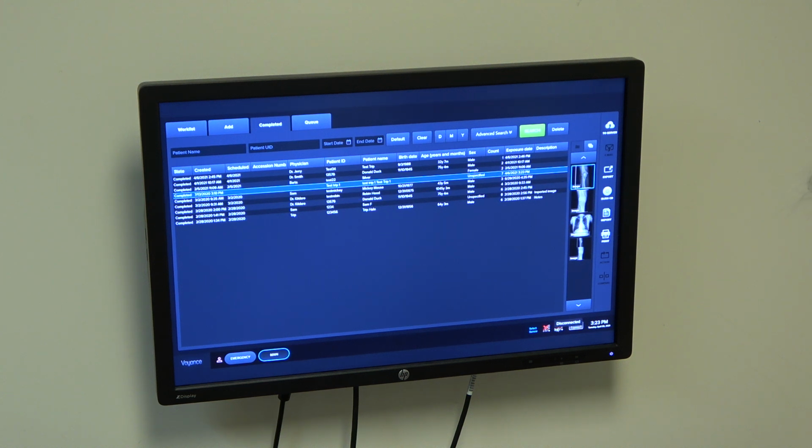We have, in this case, we want to talk about the dual panel. This system works very well in what we call a hybrid dual panel environment. So what we would do is we would sell the customer, or the customer would purchase 2 wireless DR panels. In this case, it would be the 17 by 17. You can do it with a 14 by 17. Typically, we sell 2 17 by 17 wireless panels. We configure it when we set them up with one router, and the router is recognizing the 2 separate IPs for the 2 different panels.